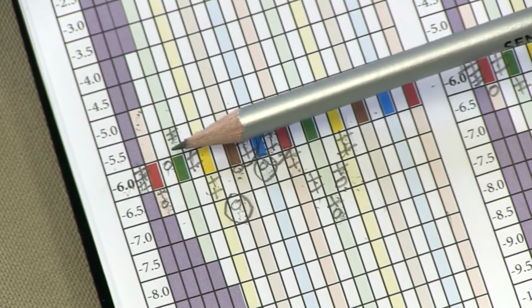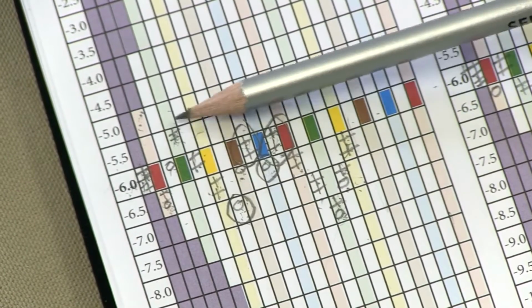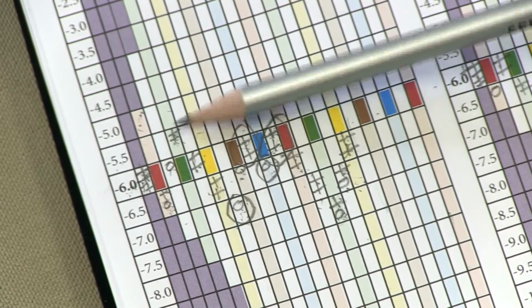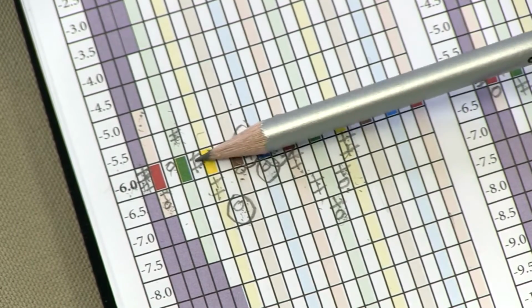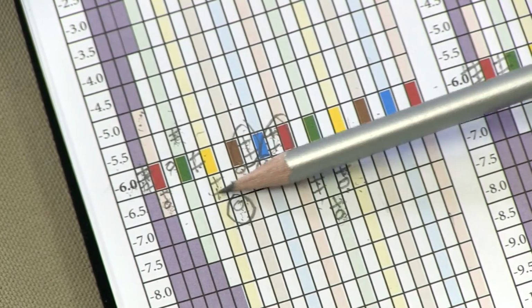Here we missed the first of the pairs, so we didn't do the second pair. We moved on up to the next highest concentration, and then we got both sets of pairs correct there, so then we moved down a single step, and then at that level we had 2 sets of pairs correct again, so we moved down.